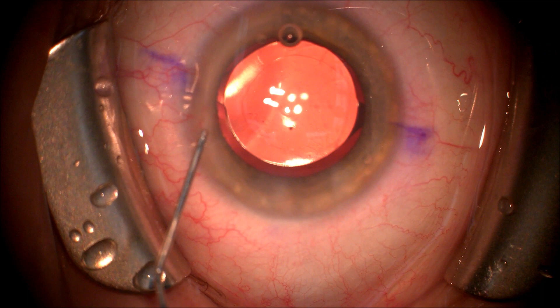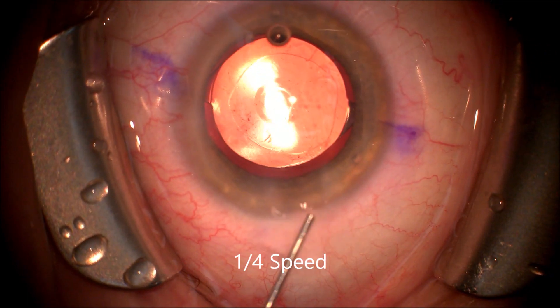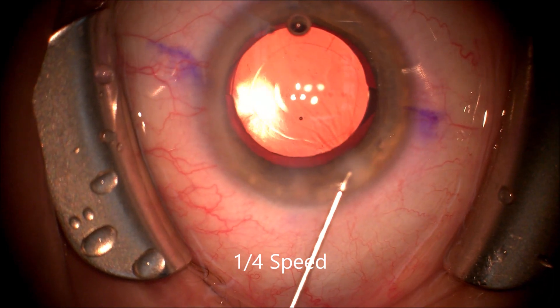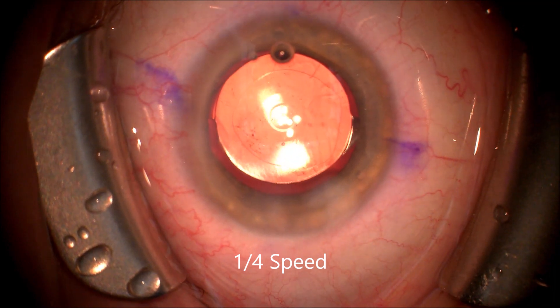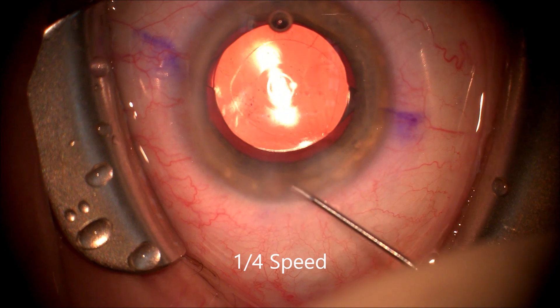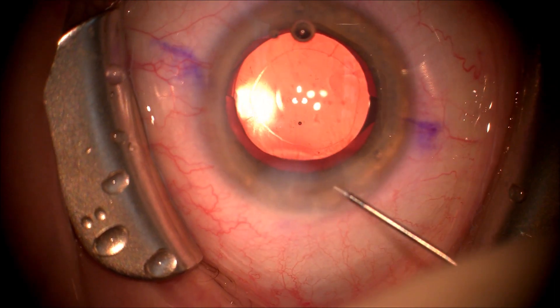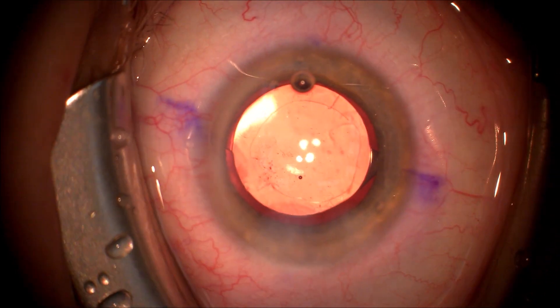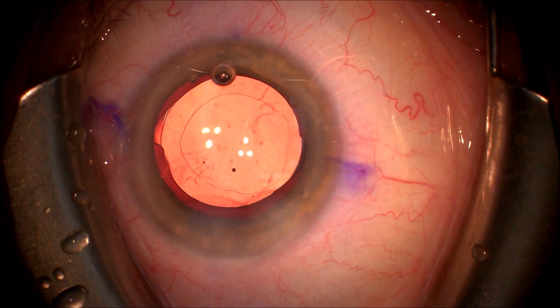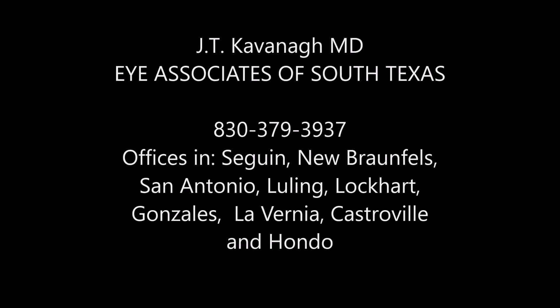We will refill the anterior chamber with balanced salt solution through the side port incision. Shown here at quarter speed is the new Vividity intraocular lens central button, which is not visible to the patient but allows the patient to have extended range of vision using two smooth surface transition elements on the anterior surface of the intraocular lens that work simultaneously to give a good range of focus versus distinct focal points.